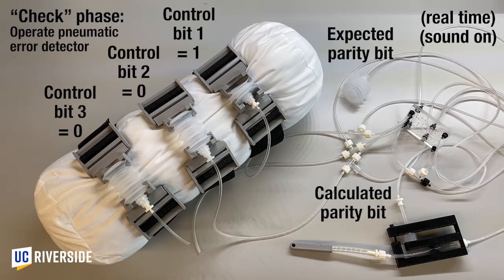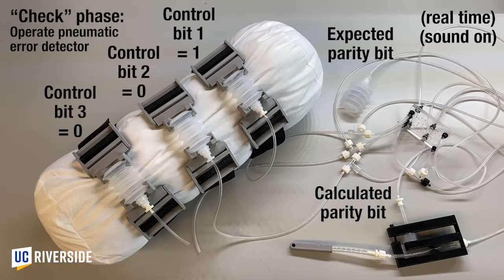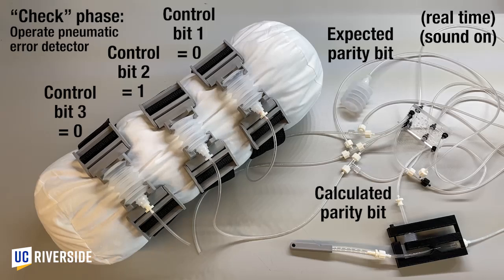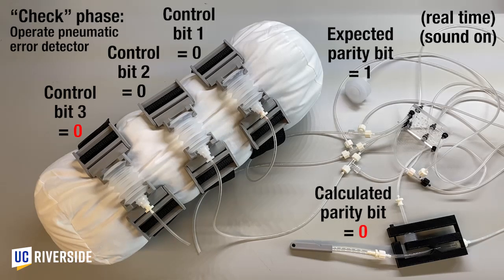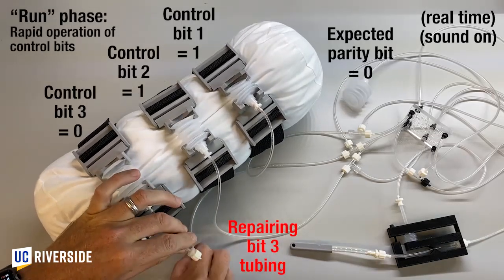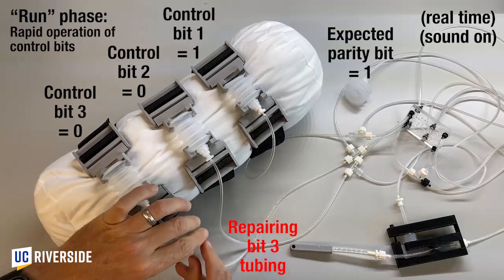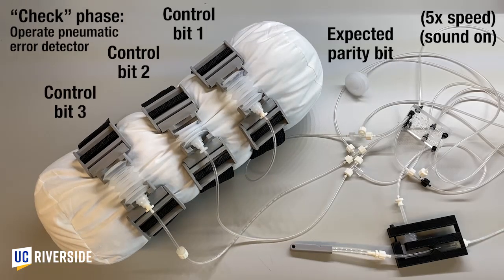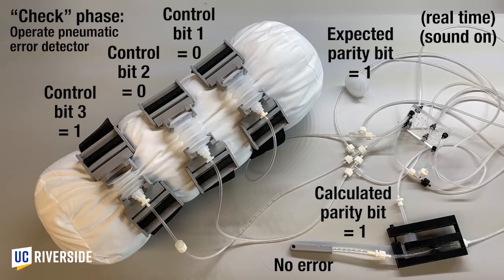When the controller tries to apply vacuum to control bit 3 in the next step of the check phase, the vacuum is vented through the cut tubing. This causes the pneumatic error detector to calculate a parity bit of 0, which disagrees with the expected parity bit of 1. The resulting error signal from the error detector causes the whistle to be blown. Finally, when we repair the cut tubing, the error is resolved and the whistle does not blow.